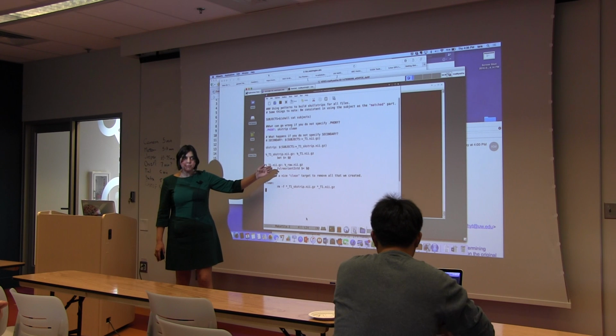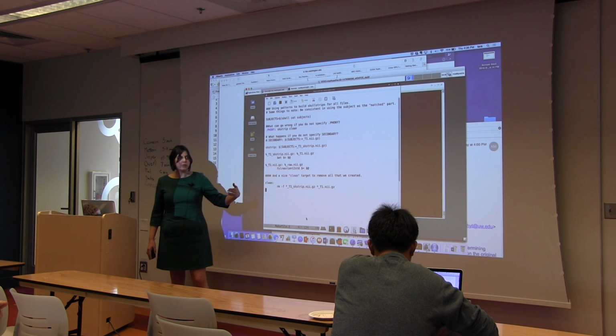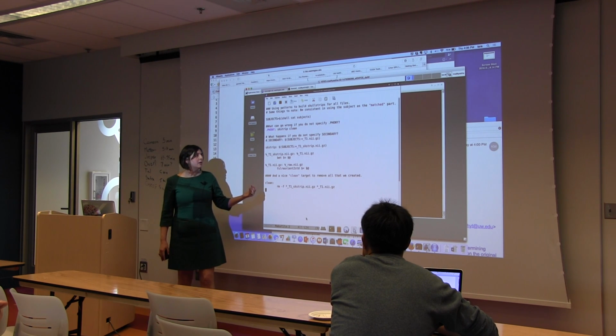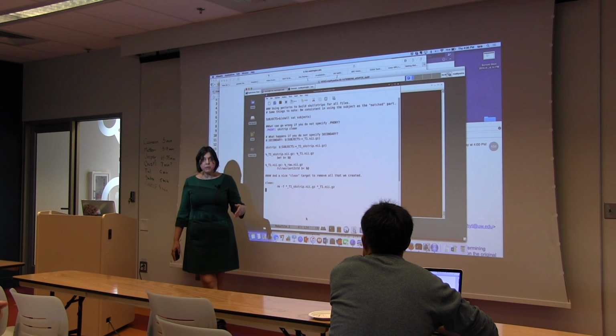That's what we want. The reoriented T1 images, or sorry, the T1 images, which are the reoriented raw images, are just a byproduct on the way. So what's going to happen is you will see that they will get created because they have to be in order to do this processing, but then they will be deleted at the end because they're not specified as targets that we actually want to create.